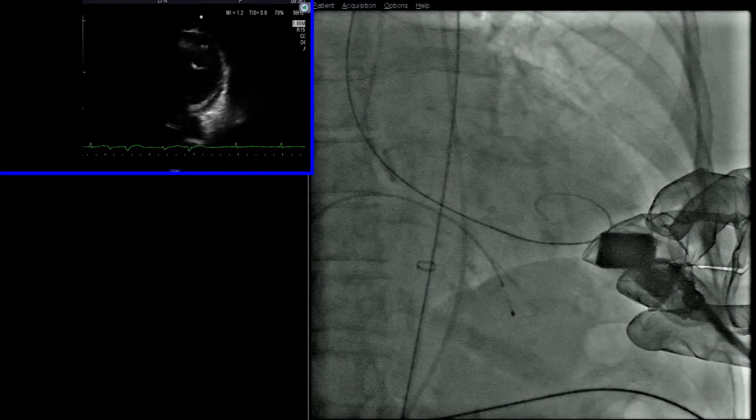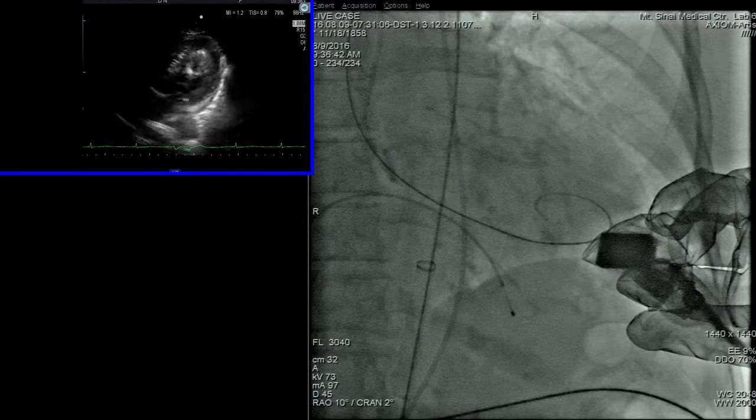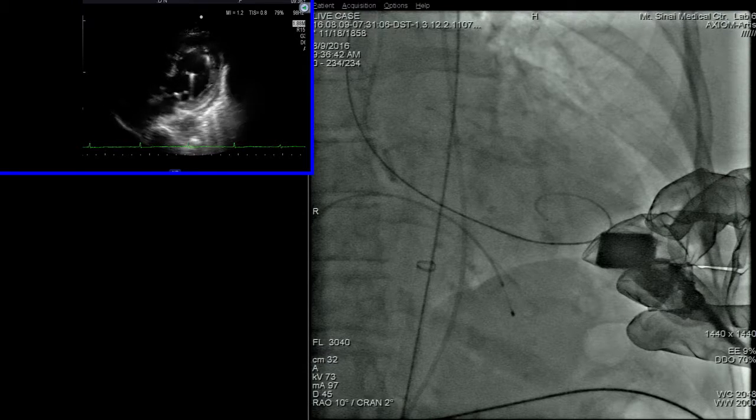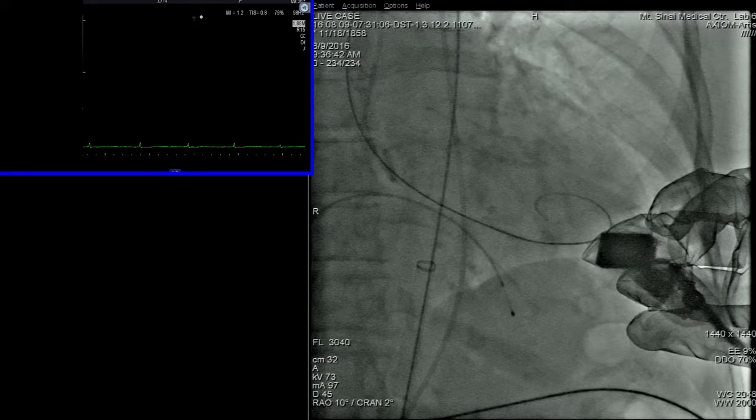So therefore, Pedro, we're deciding to do the valvuloplasty because of the tightness of the valve, and just at the leaflet level calcification. We saw there's no outflow, there is no supra-valvular calcification, so it's just the leaflet. So we'll do a 20 millimeter without the pacing.